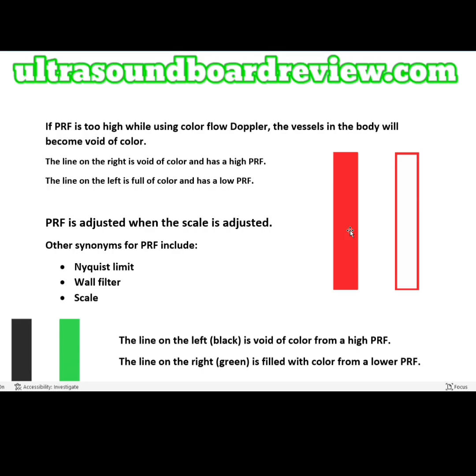This line represents a vessel that's filled with color, meaning the PRF is turned down so that the vessel will fill with color. PRF is high here, which is making the vessel void of color. The PRF is low here, but not too low that it's causing aliasing.